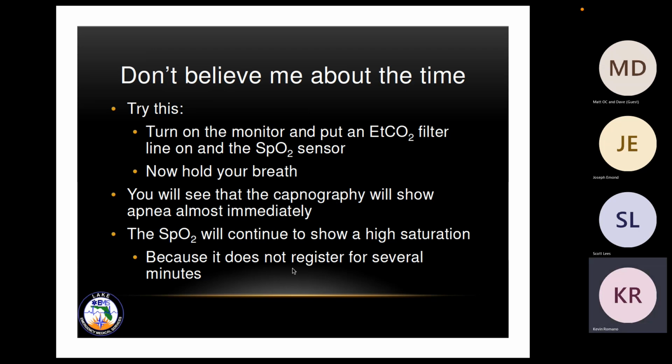All right. So you could have a patient, if you're not paying attention to your patient, let's say a BLS discharge, okay, and you're monitoring pulse oximetry and vitals every 15 minutes, no cardiac monitor. The patient could stop breathing on you for like 3 minutes, become apneic before you start seeing a major decrease in pulse oximetry. At that point in time now, the patient has had no oxygen coming in for 3 minutes. How long does it take for brain tissue to start dying? And heart tissue? What are your thoughts?